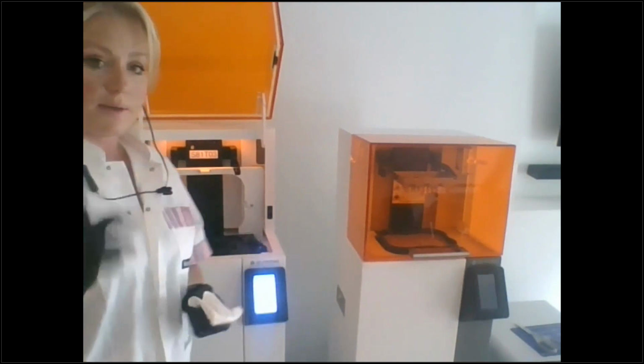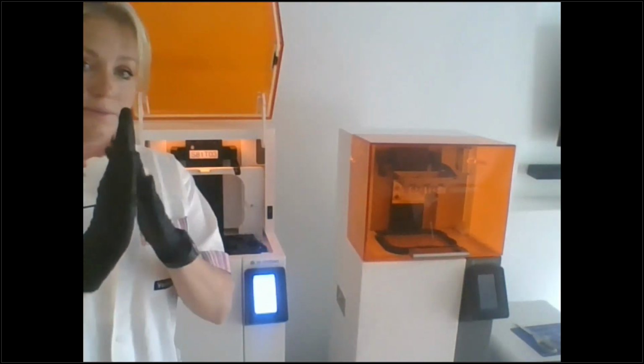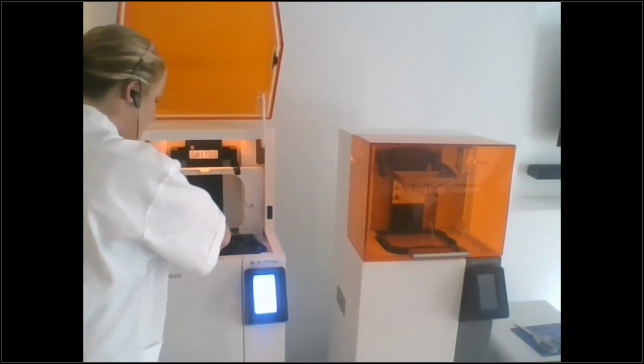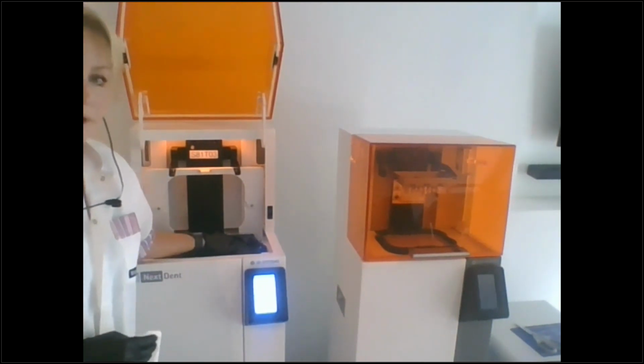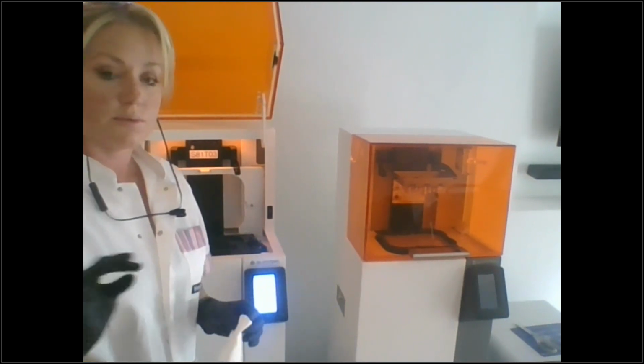And I showed you to clean this and there's one more portion that you need to do and that is to make sure your build platform doesn't have any residue at all on it. So I'm just going to clean this, make sure it's clean. And if for some reason you were to drop something on here and make a chip, just call us and we will show you how to use the proper sandpaper.